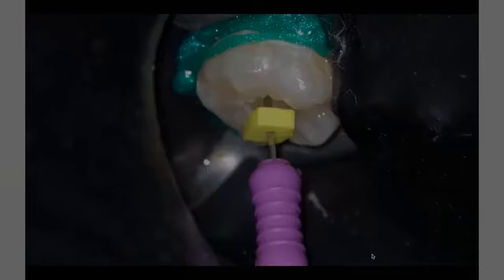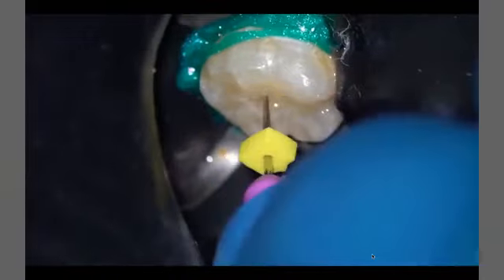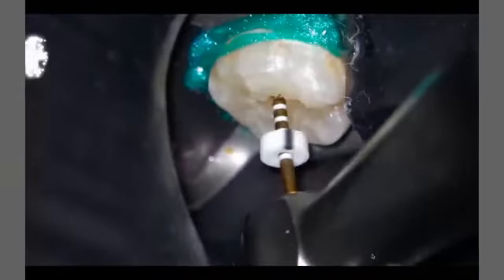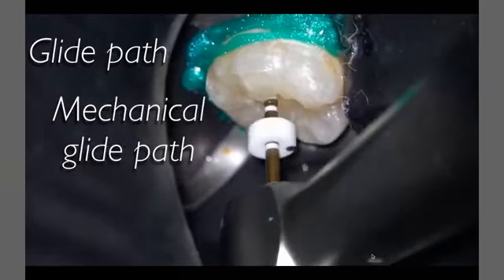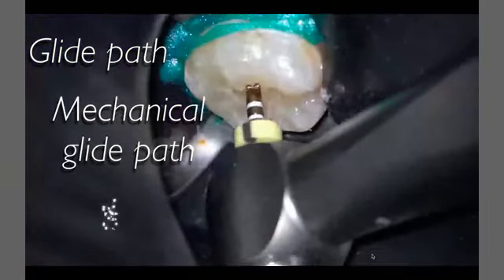After that, you can proceed with your normal root canal procedure and do the same for the mesial root canals also. Remove calcification with ultrasonic tips, glide path with the manual K files. When the 10 K file is loose at the working length, try to use the rotary glide path file to enlarge the glide path done with the manual files, and then go to the shaping.